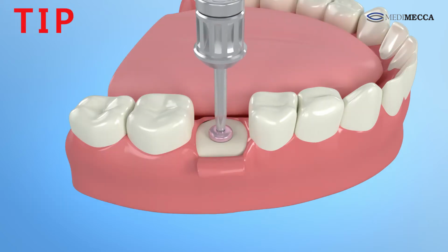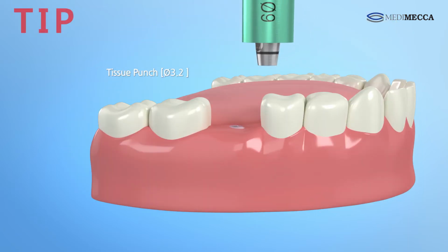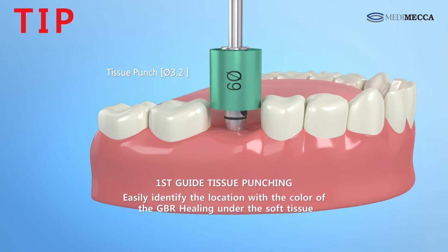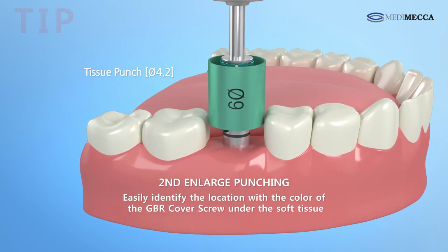Secondary surgery becomes more convenient when using surgery utilizing GBR healing. If the GBR healing position is clear, skip the first punching and immediately perform the second punching.